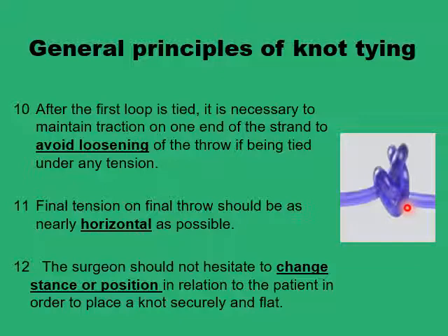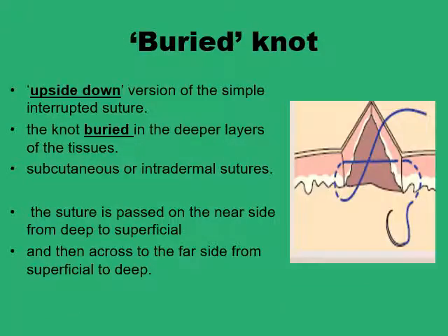And if a change in the surgeon's position or the hand's direction is required, then don't hesitate in doing this in order to apply the best possible direction of force that maintains tension while the suture is being tightened.